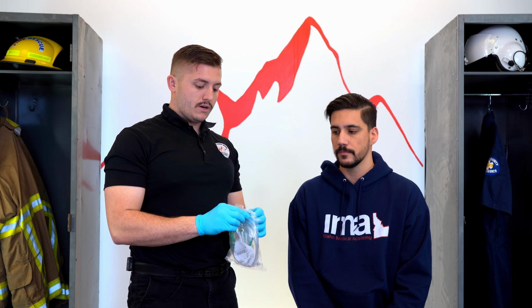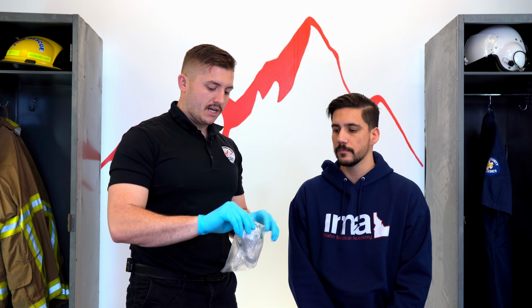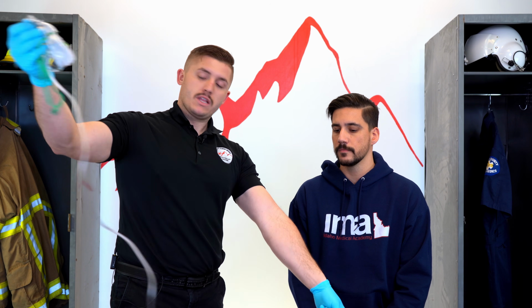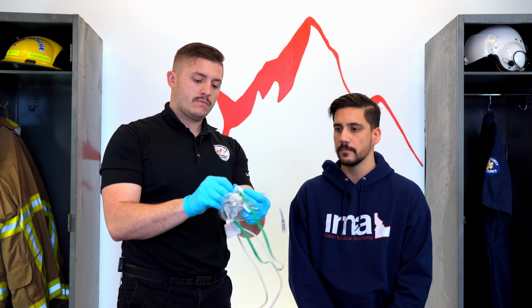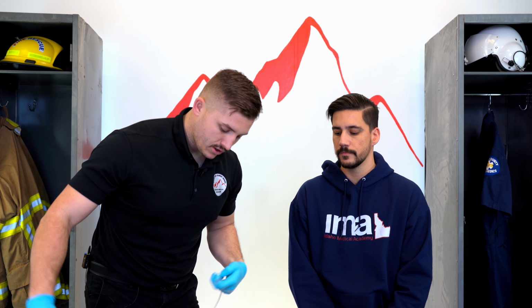For the non-rebreather, again, we're going to take our new non-rebreather. I'm going to open it. Sometimes the tubing's connected, sometimes it's disconnected. Currently it is connected. Get the tubing. I'm going to unfold my reservoir bag. Make sure I have an adult mask for my adult patient. I'm going to place this on my oxygen regulator.